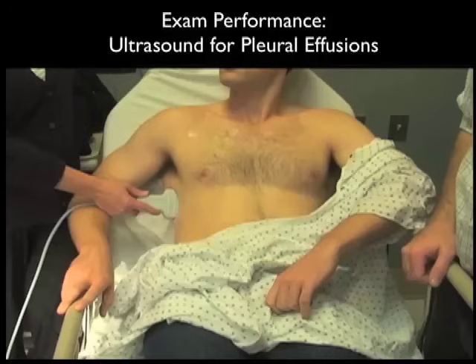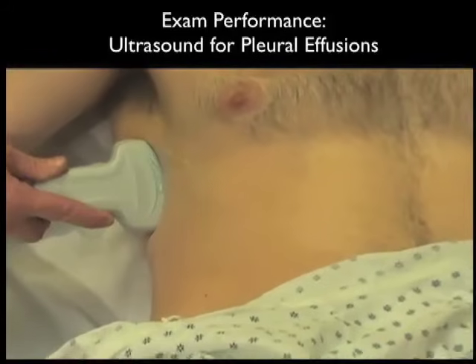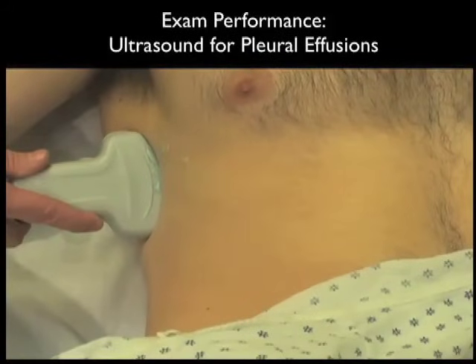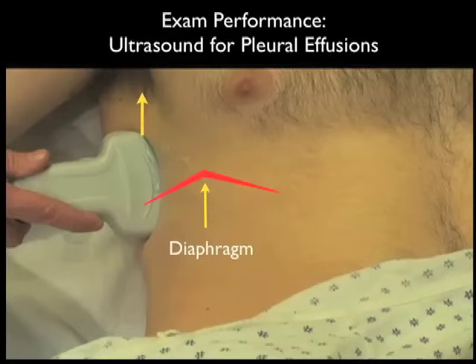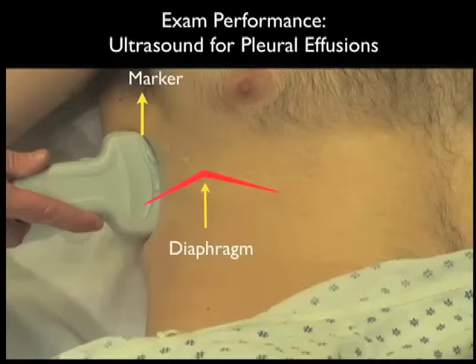Here's a video going over how to perform the examination. Notice the probe is placed into the right upper quadrant trauma FAST area and angled upwards into the thoracic cavity to fully investigate for pleural effusion. The level of the diaphragm is shown by the red marker, and the probe is positioned coming into that area just above the diaphragm into the thoracic cavity. Traditionally, the probe should be in a long axis configuration with the marker dot towards the patient's head. If a fluid collection is seen, one can then move the probe upwards to fully investigate how big the effusion is. To optimize your examination, place the patient with the head slightly upwards so that the fluid will layer out above the diaphragm, allowing earlier detection of smaller amounts of fluid.